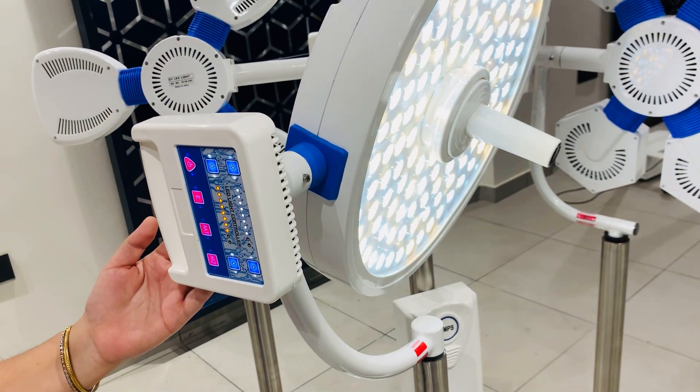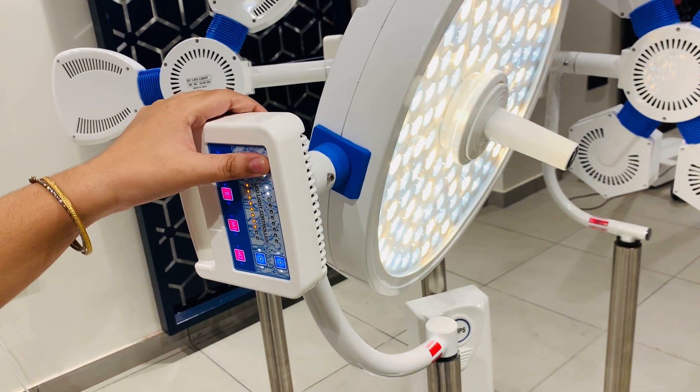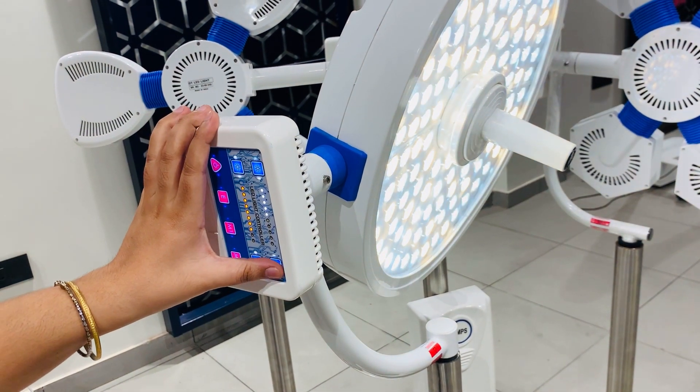Now I will let you know the features of this touch controller. From here you can decrease the white light, and from here you can increase the white light.